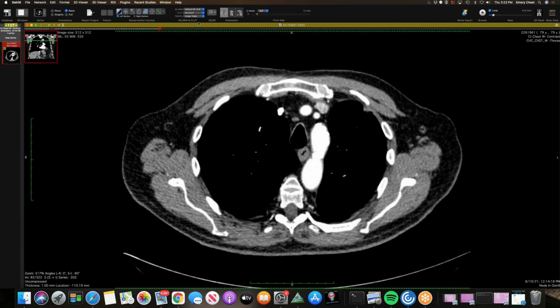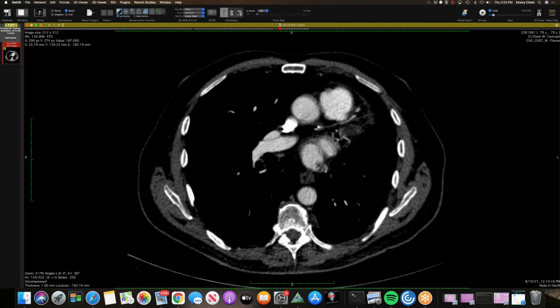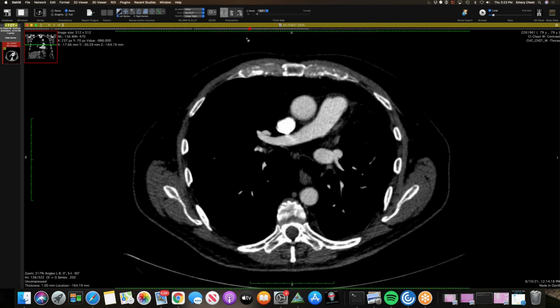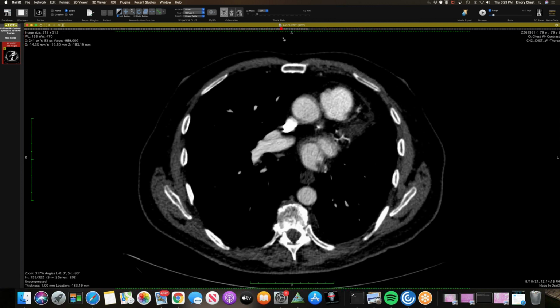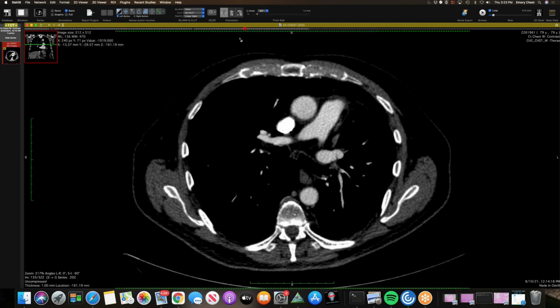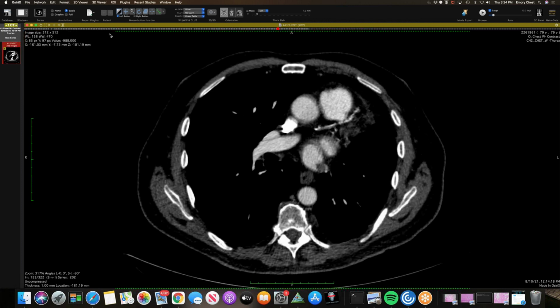Okay, this is a very straightforward case, but I hadn't seen one of these in a long time or ever. But they are reported. This is a patient with a left lower lobectomy, but I did notice they had clot in their stump there. I've seen a lot of lobectomies, but I don't recall seeing one of these. It's post-lobectomy thrombus. I've seen them in arterial stumps, but I don't recall seeing one in a venous stump. It's usually after a pneumonectomy in the arterial stump, because usually when they do a lobectomy, they don't leave much of a stump. I looked this up, and there are definitely reports. There was a paper, and they talked mainly of the left superior pulmonary vein. This one's in the left inferior vein. I just found it interesting. I had never seen it before.